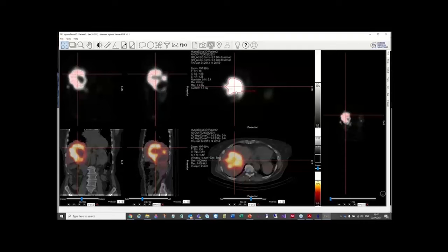So actually, we do have a question now, Helena. Great. Okay. From David Hall from Bristol. Thank you, David. I can read it out anyway. It says, given all the uncertainties mentioned earlier, should we be using lutetium dosimetry outside research centres and trials? Even if we can calculate a number, should we give it to clinicians?